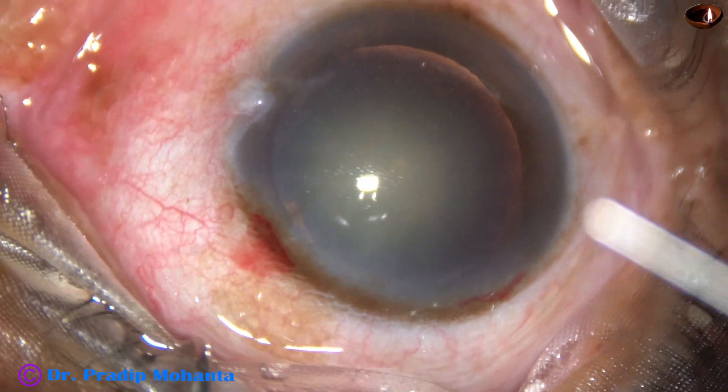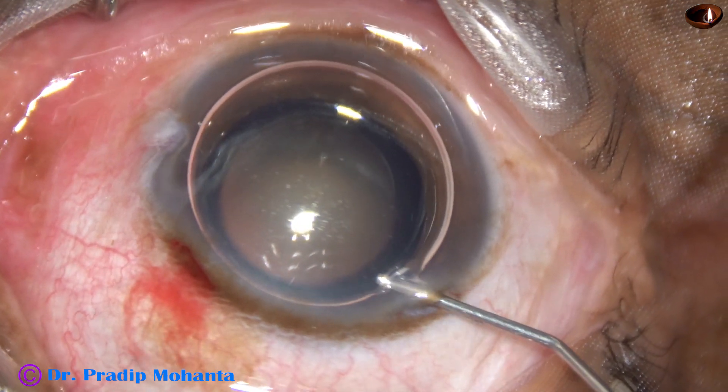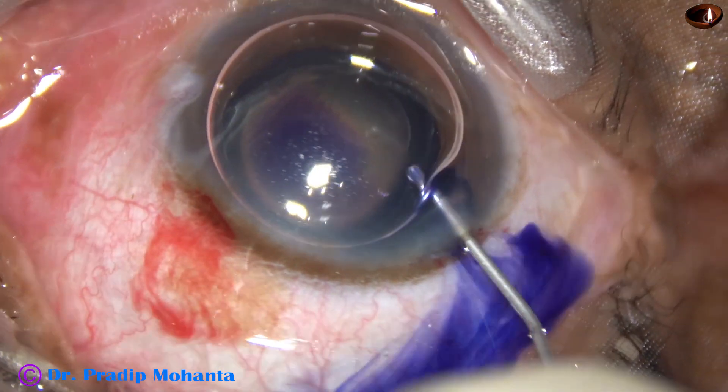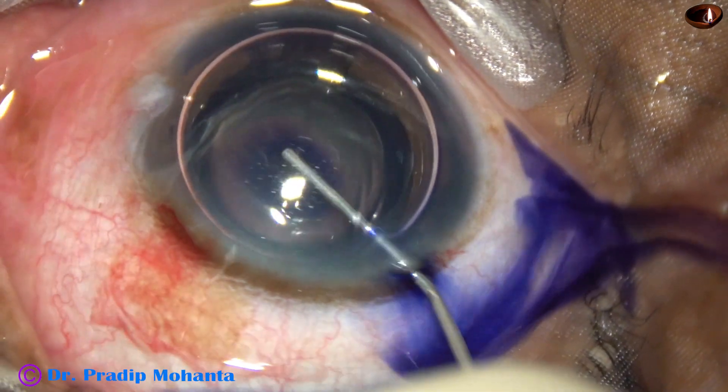An air bubble is injected into the anterior chamber and the anterior capsule of this cataract with grade 3 nuclear sclerosis is stained with trypan blue dye.